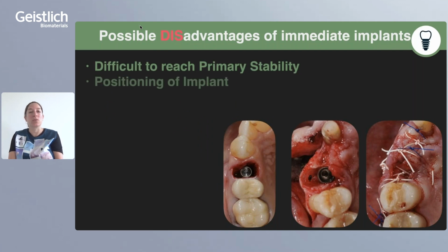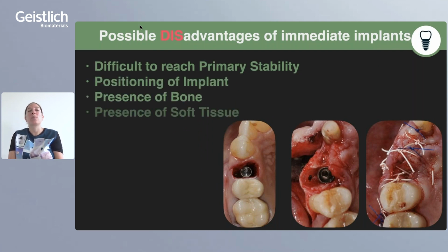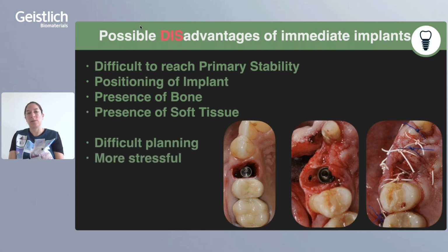But there are also quite some disadvantages when placing immediate implants. It is much more difficult than placing an implant in a healed site.